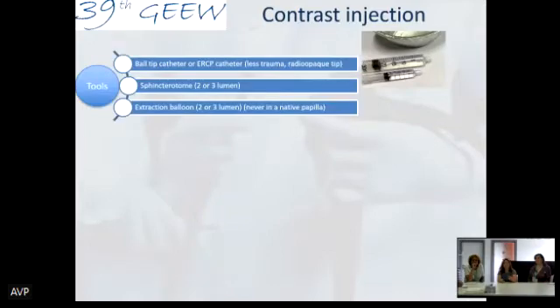So when the physician is going to use a device to get into the papilla, he will use a ball tip catheter, whose tip is radiopaque and less traumatic, or the sphincterotome. The sphincterotome, we usually use 3 lumen. The sphincterotome has the bonus of being able to bend it a bit, so you can also have a predetermined orientation to get into the bile duct.